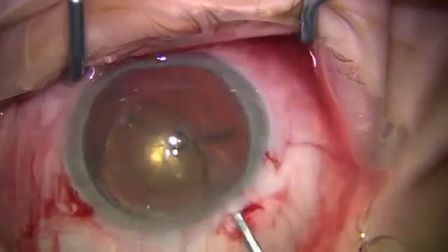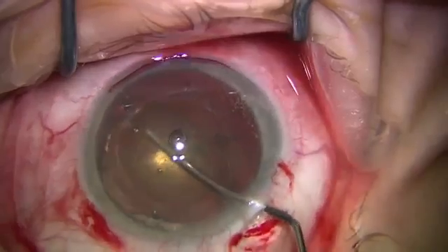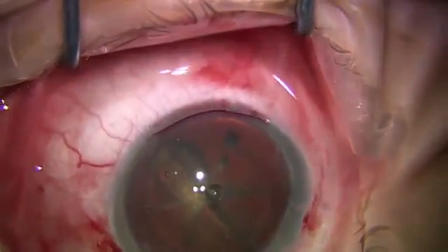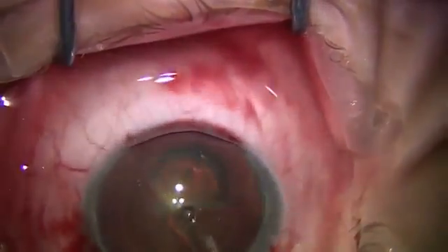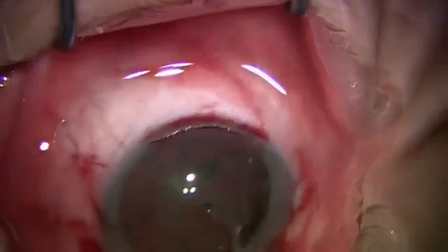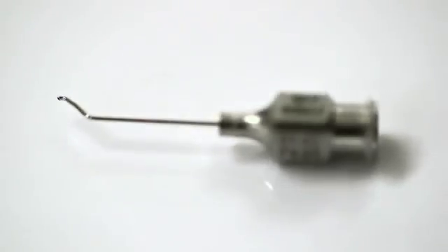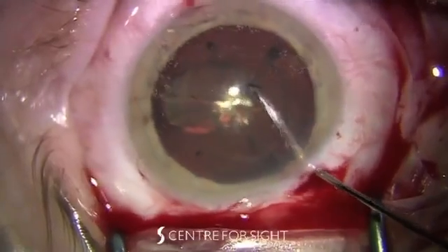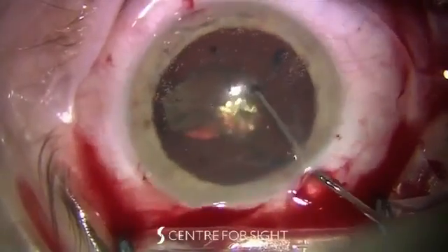On one occasion, while performing this maneuver and breaking up the lens with a hydrodissection cannula, fluid was mistakenly injected, resulting in a perfect fluid wave with good lens mobilization. The procedure was repeated purposefully and successfully case after case. Translenticular hydrodissection was born. This discovery led to the development of a cannula which served to both chop and hydrodissect the lens simultaneously. Watch the fluid wave and displacement of posterior gas as fluid is injected into the fragmented lens incision.